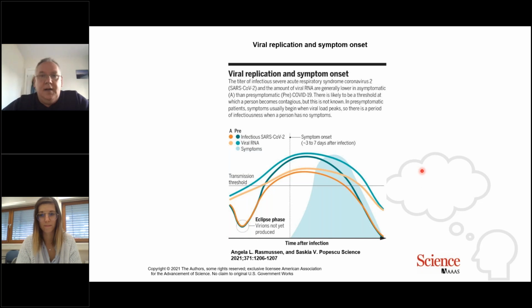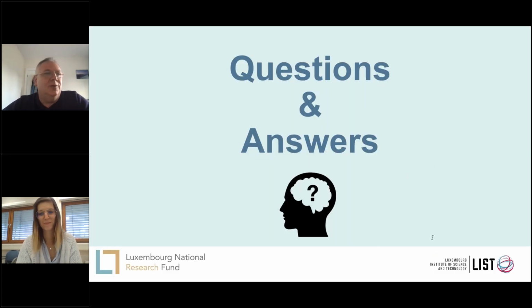No, we want to do this. Initially, we were very hell-bent on just doing gargle, and we realized, well, we're stupid, we need to be looking at the same samples. We had assumed that the transport medium would destroy the protein, but in some of the experiments we've done, very preliminary, it doesn't. We still see the proteins there. So we very much want to do that, and we very much welcome collaboration with groups across Europe to do this.